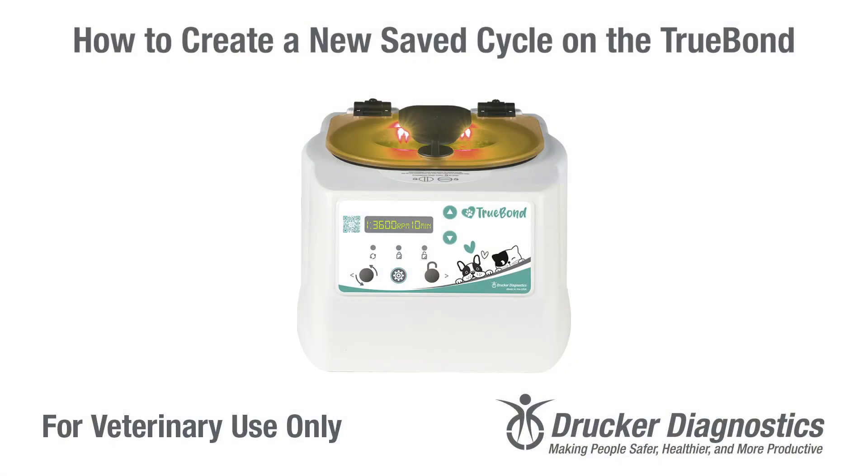Hi, I'm Dawn with Drucker Diagnostics, and today we're going to learn how to create a new saved cycle on the TrueBond veterinary centrifuge.